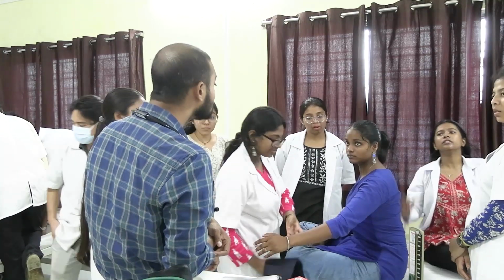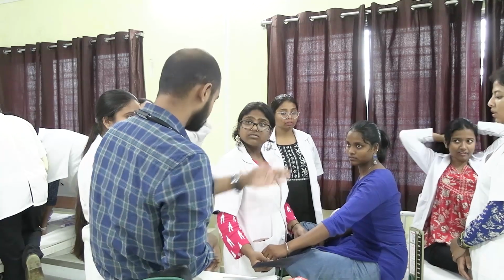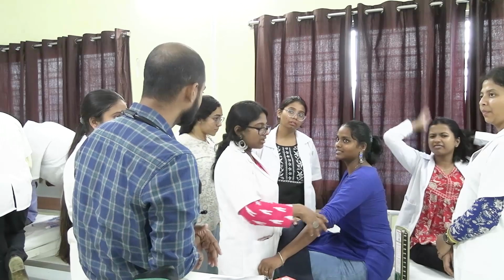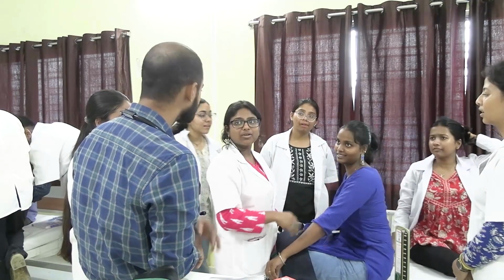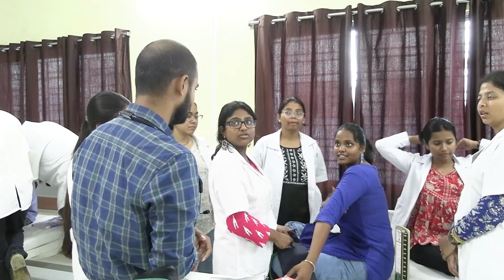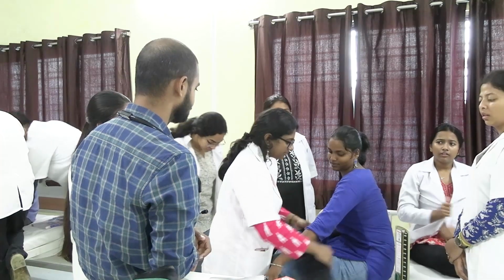And what about the cloth? Do you want to say anything about the cloth? What should it ideally be? Ideally, the arm should be bare. There shouldn't be anything. If at all there is, you're supposed to fold it in such a way that it doesn't constrict. Actually, it shouldn't be folded at all. Okay.